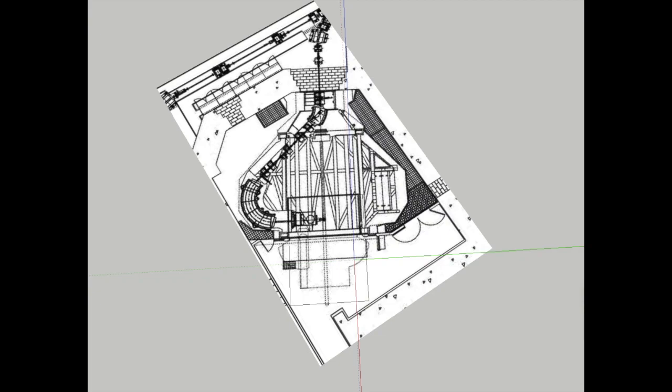I want to do an illustration of the size difference between a Gantry treatment room and a fixed treatment room equipped with upright treatment equipment. What you can see here is a floor plan of a Gantry drawing that I got off the internet. It shows the Gantry structure has a radius of about 18 feet, and you need to add another 2 feet to allow the structure to rotate around the patient.